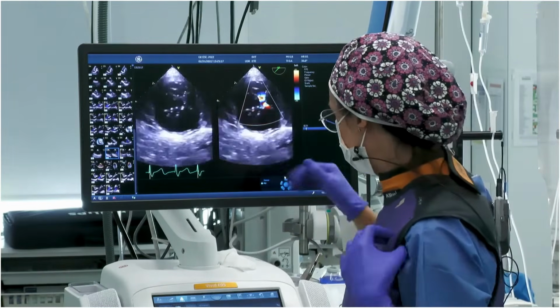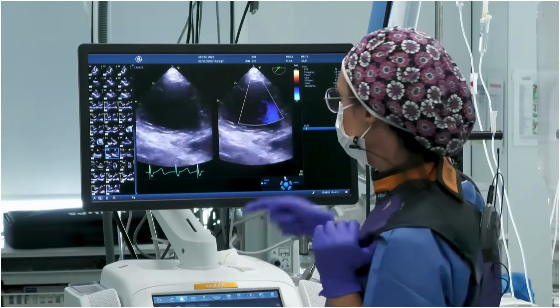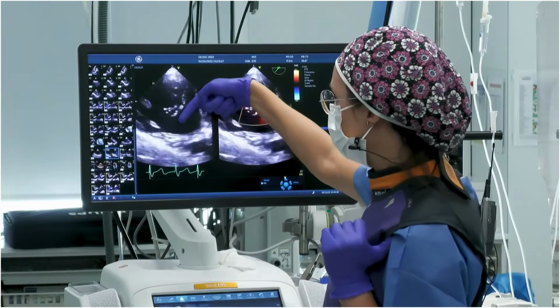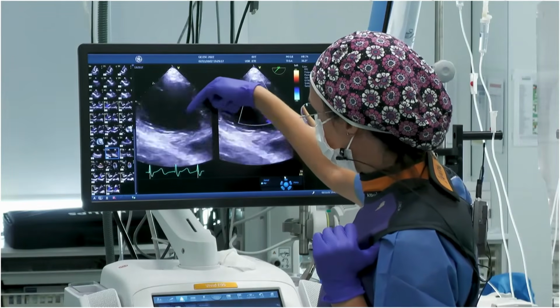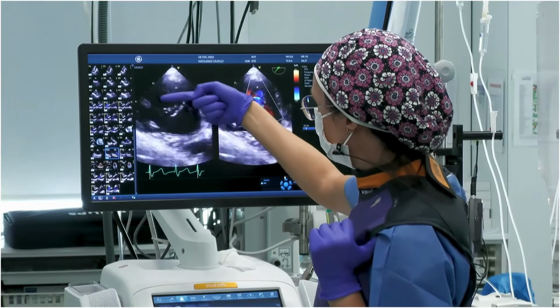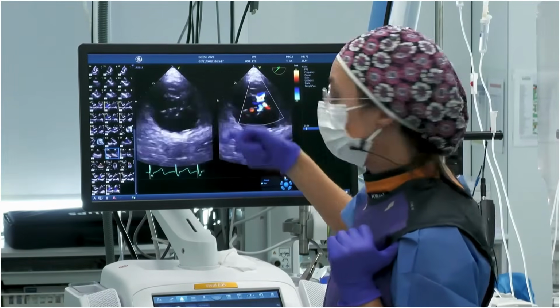It's important that you know what is the anatomy of your valve just to do the strategy. In this case, we aim to put a first clip here, probably a XTW clip, catching the septal leaflet and also the anterior leaflet, and then a second XTW here in the middle with the first portion of the posterior leaflet and the septal leaflet.